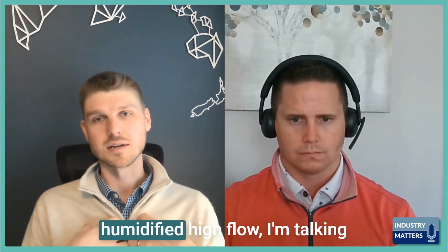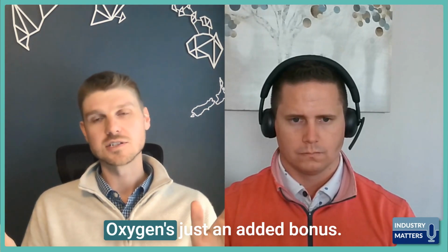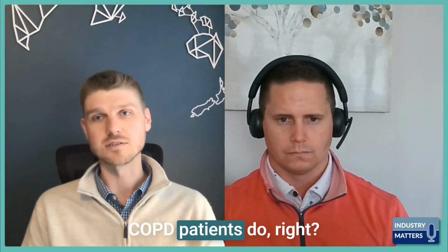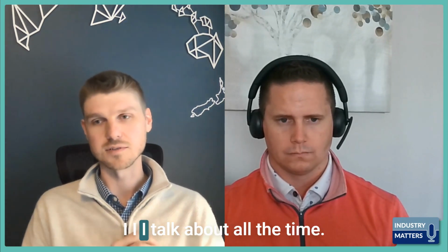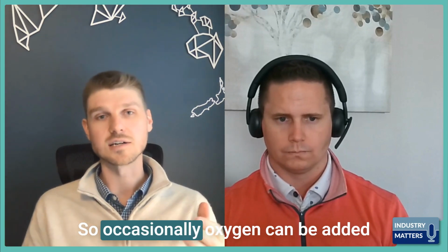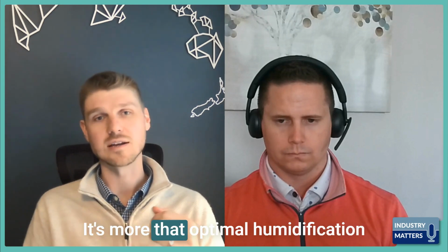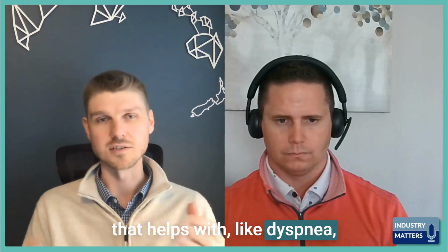When I'm talking about humidified high flow, I'm talking about humidified, warm, moist air and airflow, room airflow. Oxygen's just an added bonus. If a patient has oxygen needs, which admittedly a lot of COPD patients do, if you look at a lot of the clinical research, there's one in 2018 I talk about all the time. All of those COPD patients were on about 2 liters of oxygen with high flow. So occasionally oxygen can be added on, but that's not the main benefit you get out of the therapy. It's more the optimal humidification and the flow, the respiratory support that helps with dyspnea, shortness of breath, things like that.